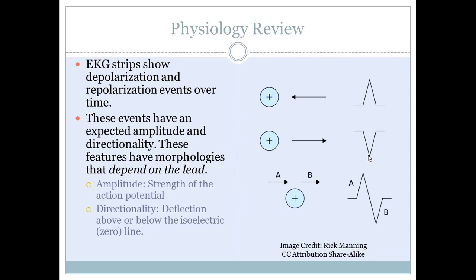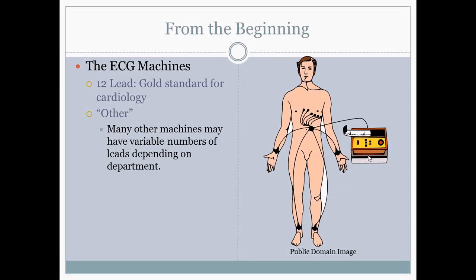And if you see a complex that has an upward and downward spike, you're seeing 2 events. The first event, which is showing an upward deflection here, labeled by A, is an event where the signal is moving towards the electrode. B event occurs later in time. It's detected later by the electrode, and it is moving away from the electrode.